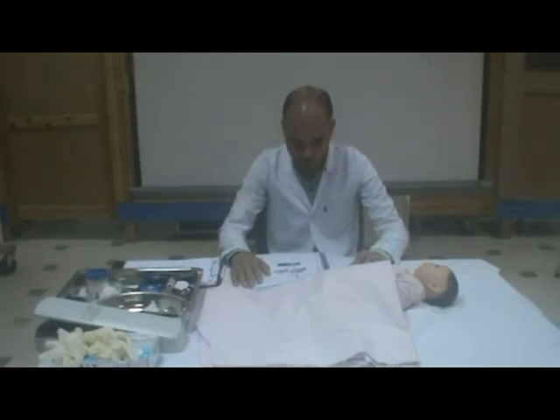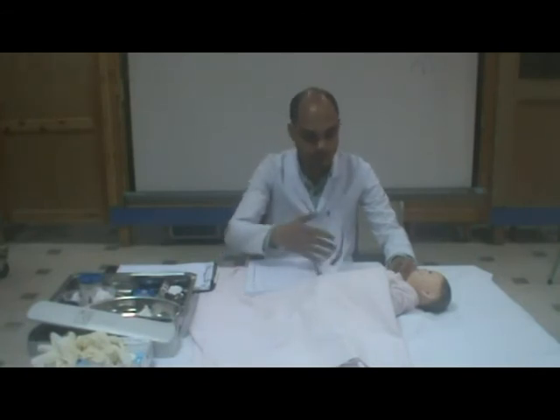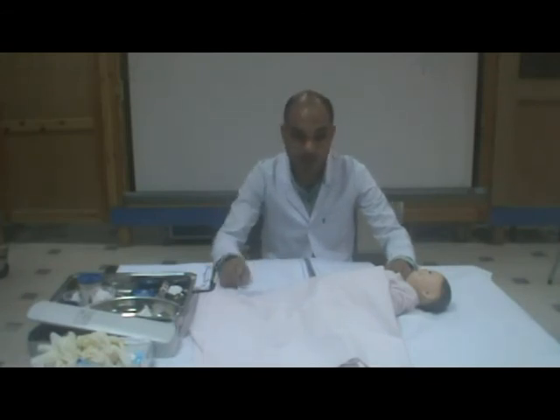Tympanic temperature. The tympanic thermometer senses reflected infrared emission from the tympanic membrane through a probe placed in the external auditory canal. This method is quick, less than 1 minute, minimally invasive and easy to perform. Temporal artery temperature. The temporal artery thermometer is quick to use. It is held over the forehead and senses infrared emission radiating from the skin.